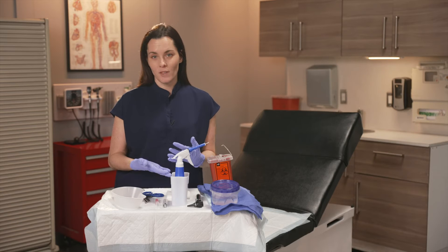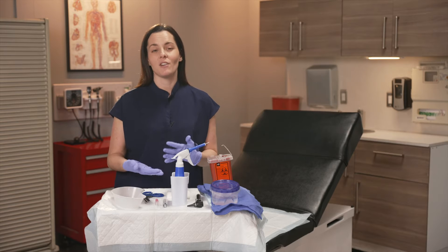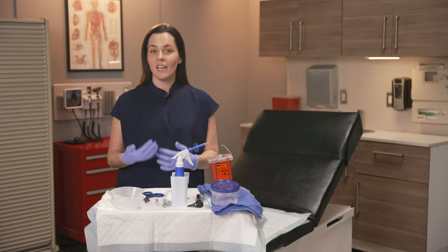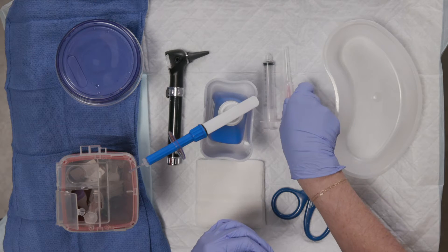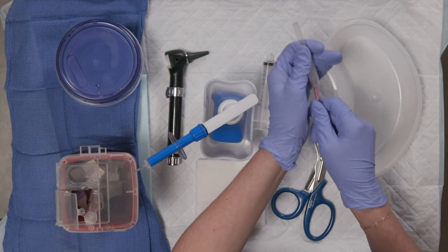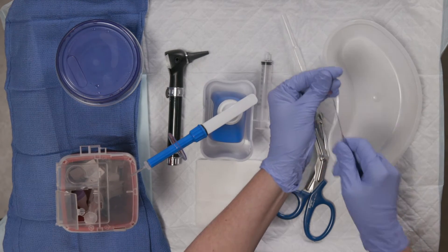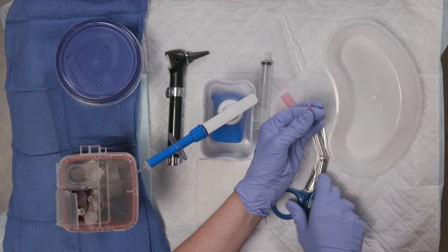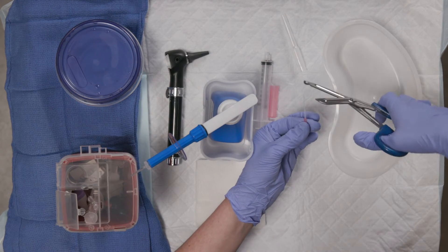If you don't have one of these devices — we don't at my center — you can create an ear irrigation device using a 10 or 20 cc syringe and an angiocatheter; an 18 gauge works really well. For this, you're going to remove the needle, discard it in the sharps container, and then trim the end of the angiocatheter to shorten it.